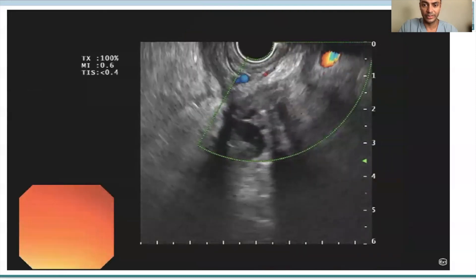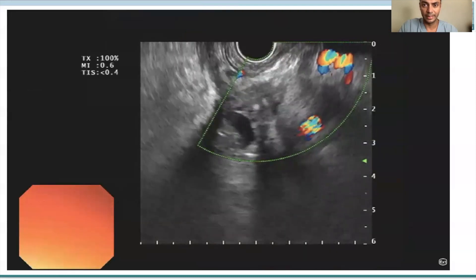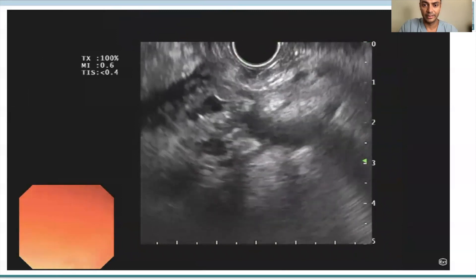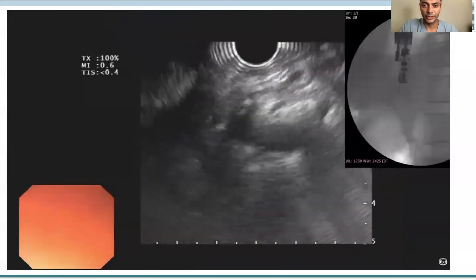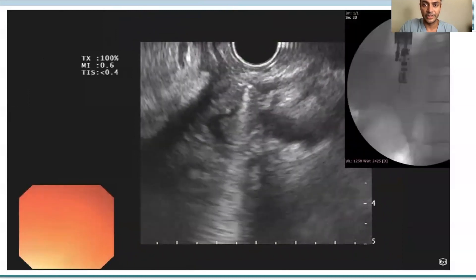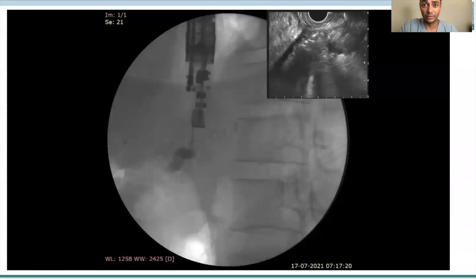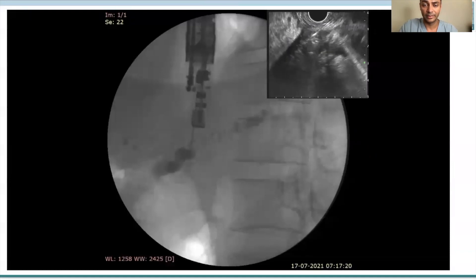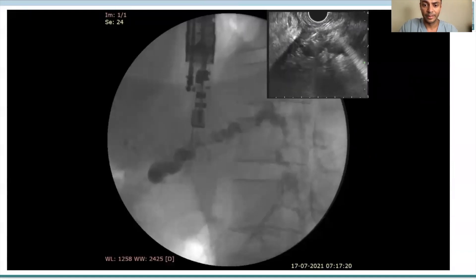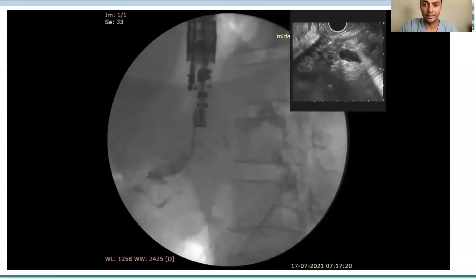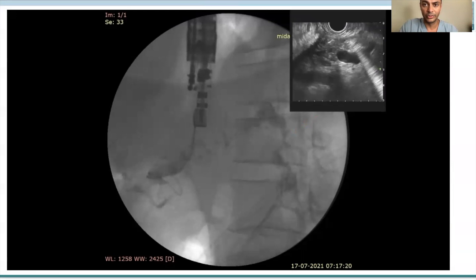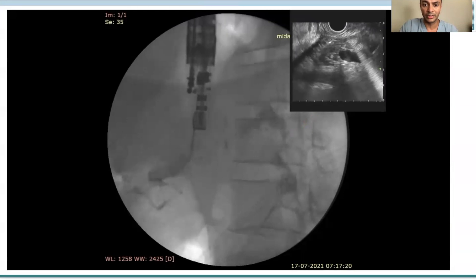What you see on the screen is a dilated pancreatic duct, looking at the body and neck region. A 19-gauge FNA needle was then advanced into the pancreatic duct and contrast was injected. You can see there is a dilated, irregular duct with a leak in the tail of the pancreas. A 0.032-inch guidewire was then coiled.